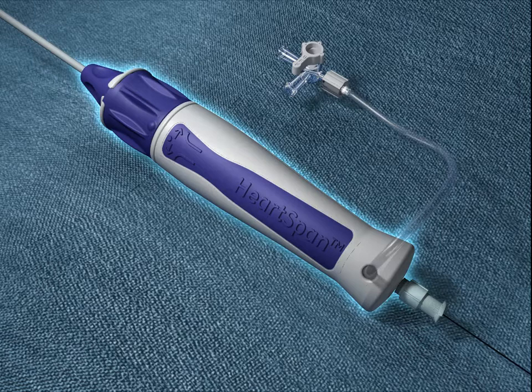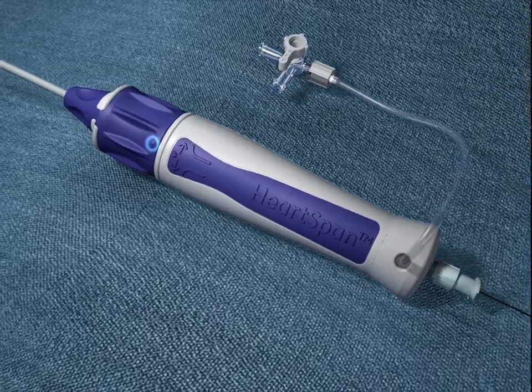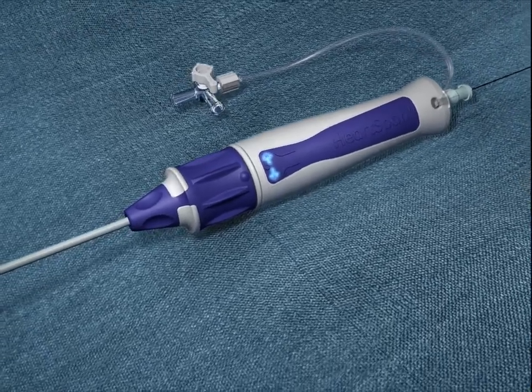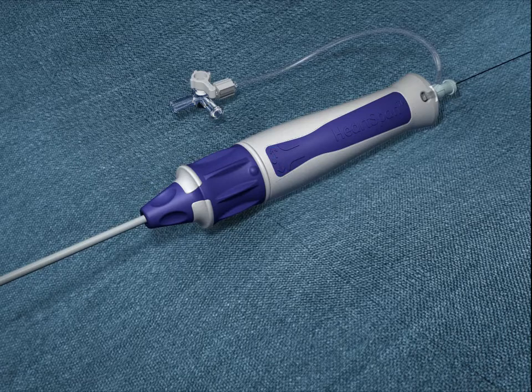The ergonomic handle is designed to reduce hand fatigue during longer procedures. The handle has a raised thumb marker that provides tactile confirmation that the sheath is in a neutral position. In addition, two arrows indicate the directional plane of the curve as the handle turns.